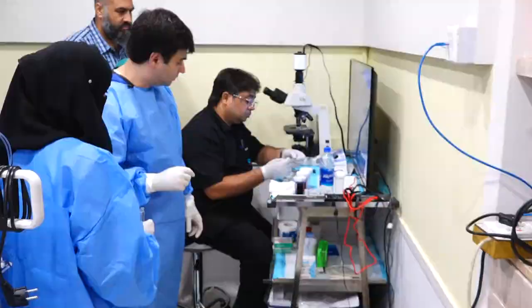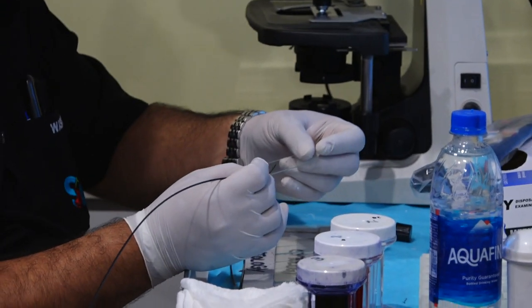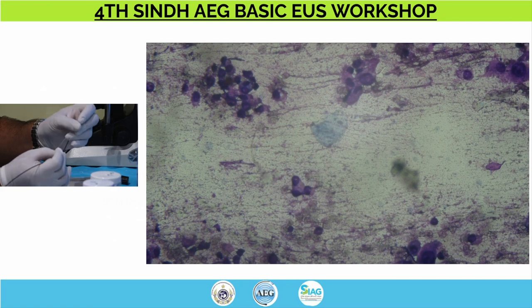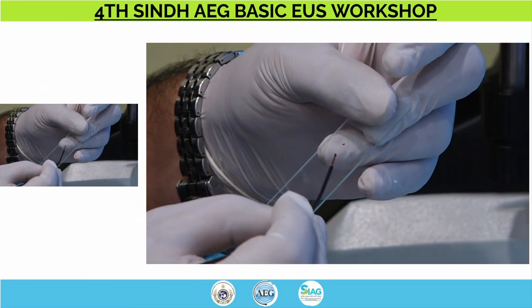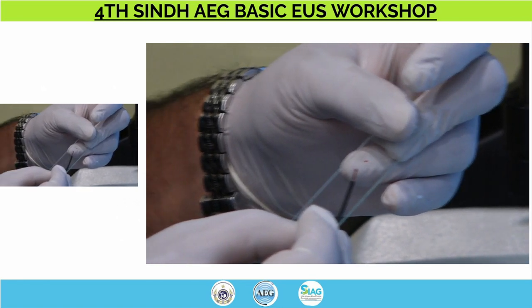So what we're doing here, Wasim has the tip of the needle exposed on a glass slide. I'm not sure how well this is projecting. Can you make those hands bigger? That camera bigger. The whole screen, up zoom, the way it was earlier. Okay, so that's Wasim with the tip of the needle exposed.